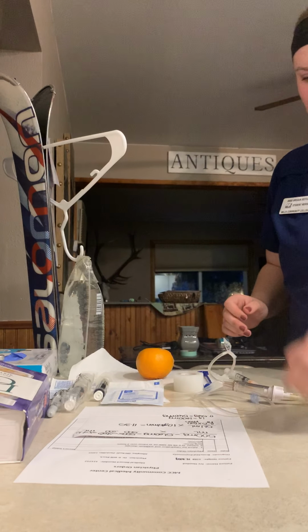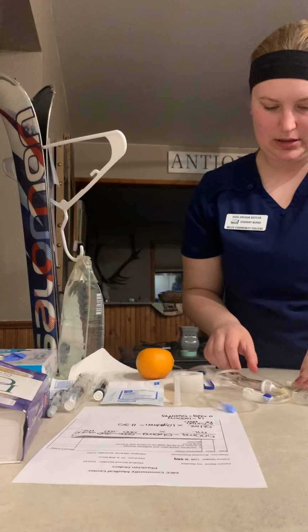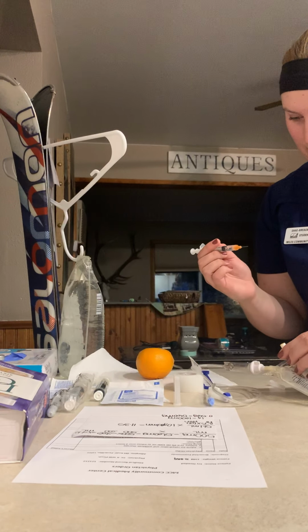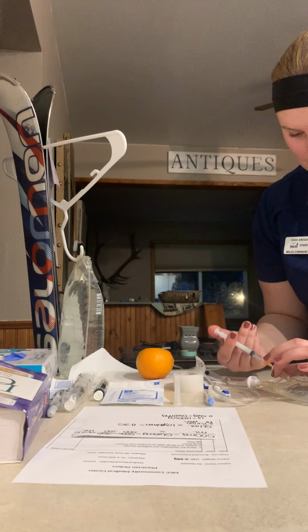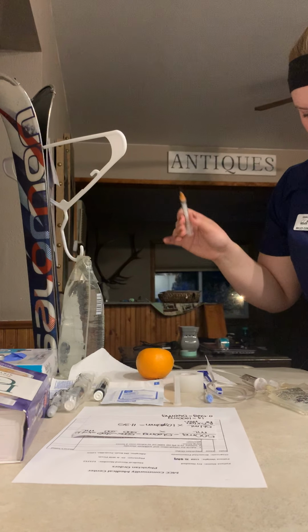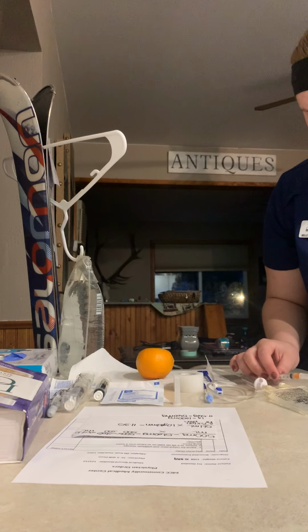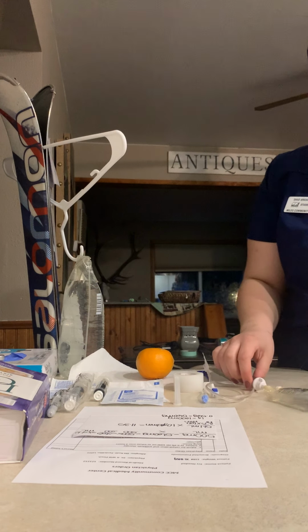Okay, once I got this, I can inject into this port here. And then I'm just going to scoop and put in my sharps.